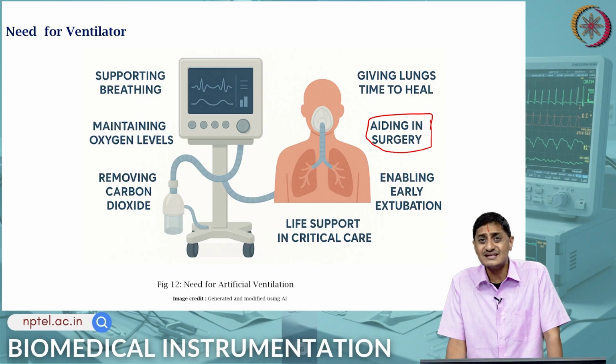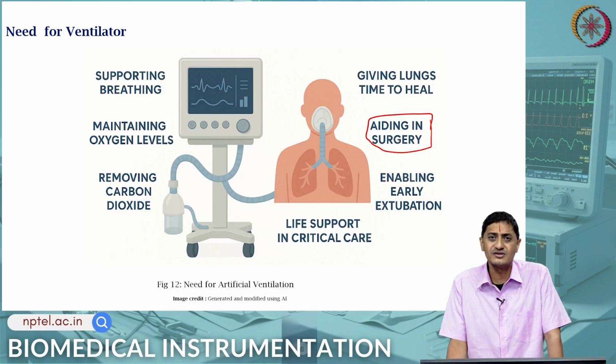But there may be cases in which ventilation might be needed because of a respiratory system disorder. Now, you need to support breathing for the patient when the person is not able to breathe on their own, and to maintain oxygen level. The person might be able to breathe, but may not be able to breathe a sufficient amount of oxygen. The other thing is to remove carbon dioxide.